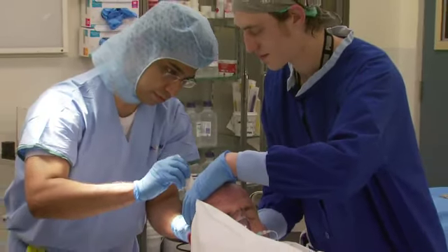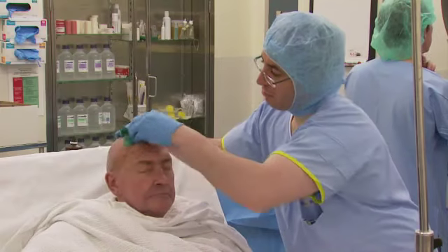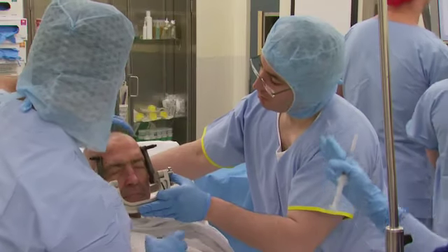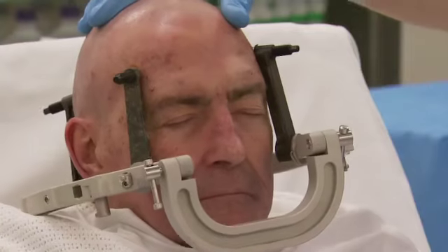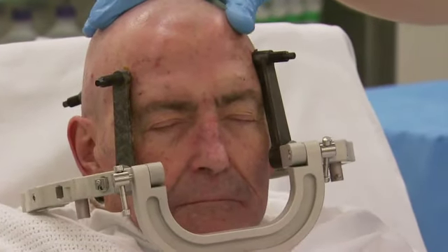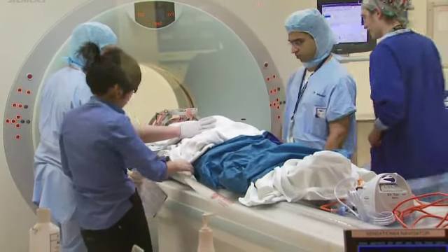Patients are generally admitted to hospital either on the day of surgery or the day before their operation. We take them down to the operating theatre and prepare them for their procedure. Their hair needs to be shaved, their scalp is cleaned, and we put some local anaesthetic in to allow us to fit the frame without too much discomfort. We also give the patient some sedation during that process and we do a CT scan.